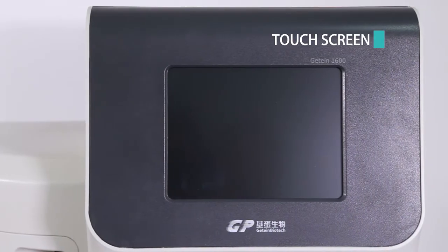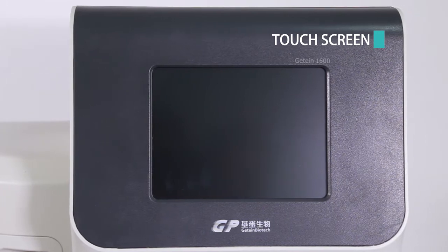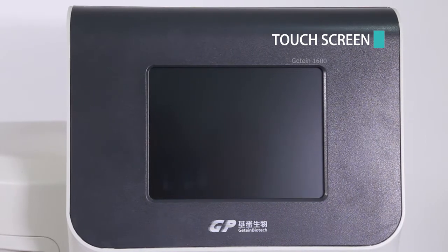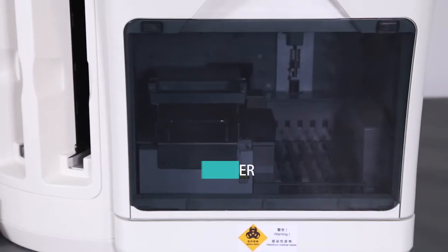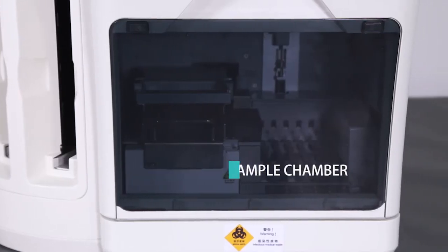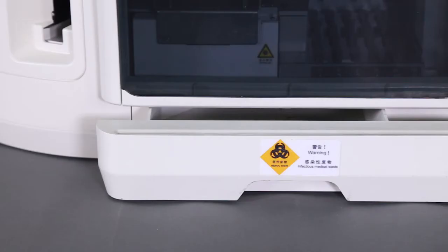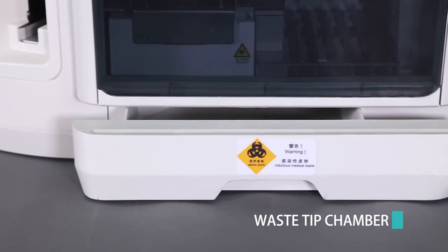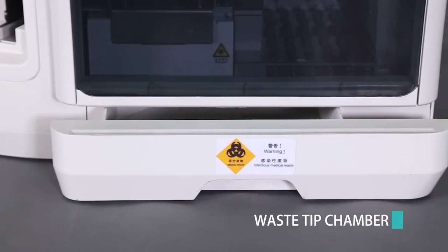On the front of the instrument are touch screen, sample chamber, and waste tip chamber.